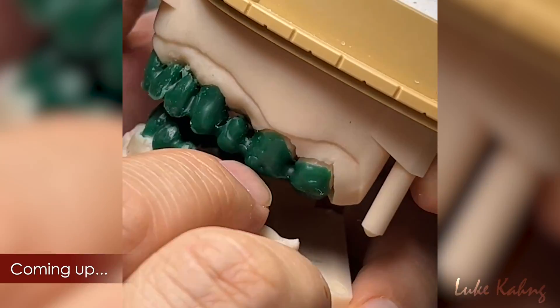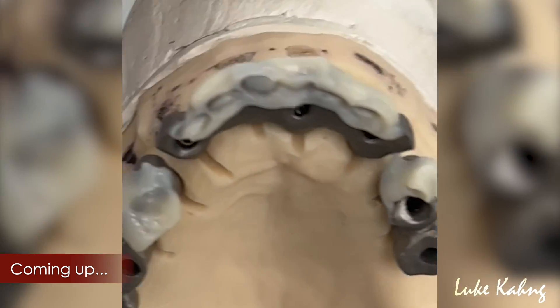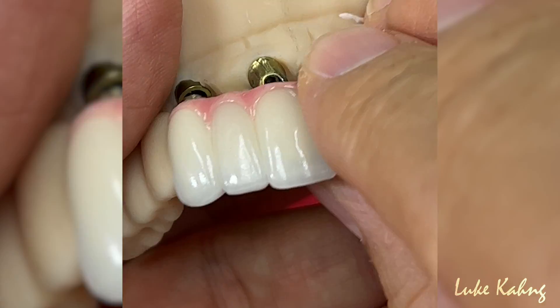After mounting, the doctor gave us a great bite. I minimize the open over here, so the ceramic is going to get better embrasure — essential embrasure.